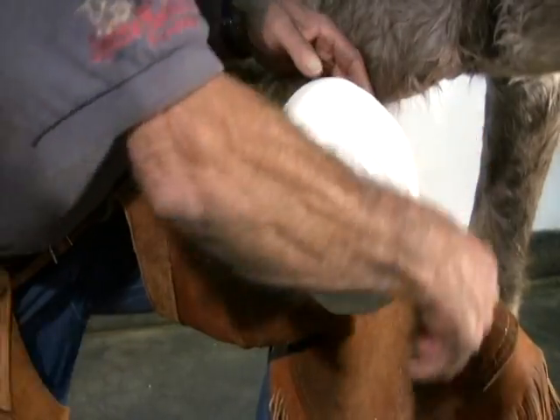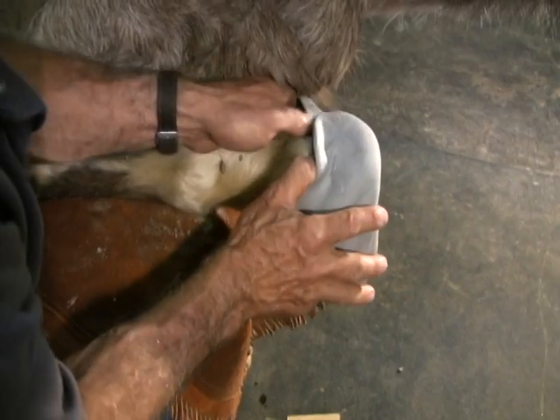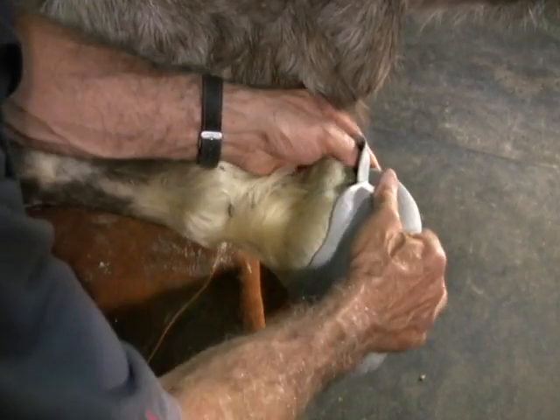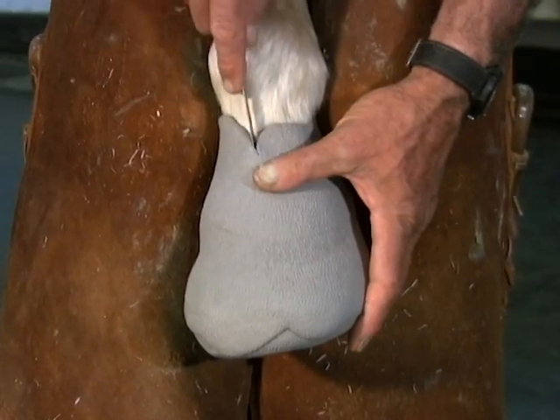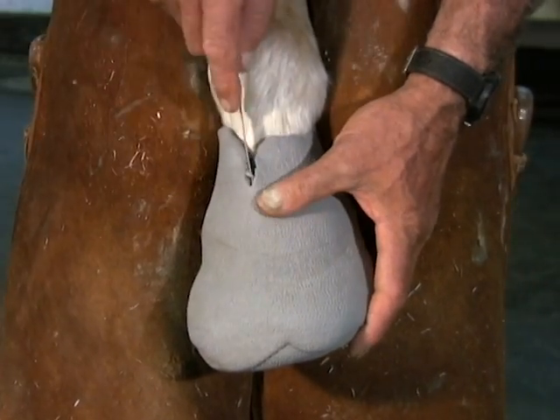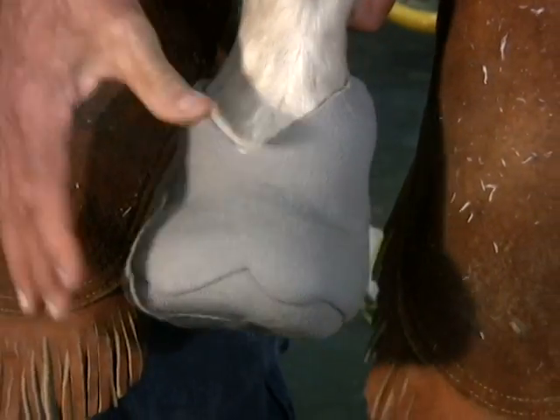Once the rubber is firm, you're ready to remove the vet wrap and pull the flexible mold off. On occasion, you will be able to remove the mold without cutting it, as seen here, and this is what the finished product will look like. But if the mold will not remove without tearing the material, it may be necessary to cut the front of the mold using a butter knife, as Dr. Redden did here.